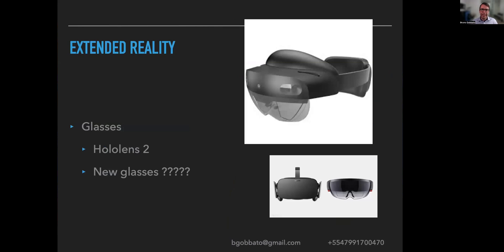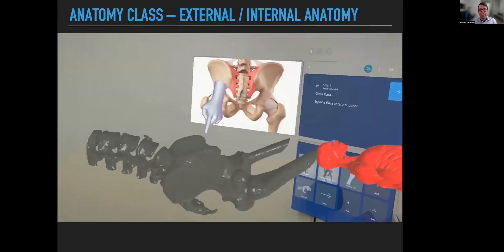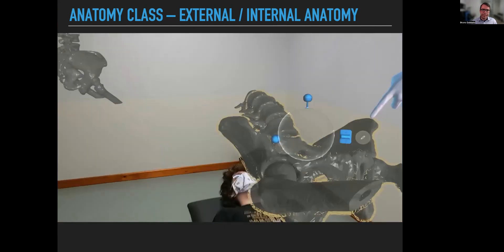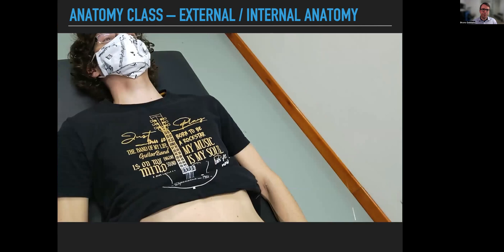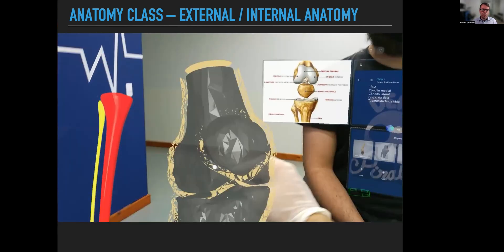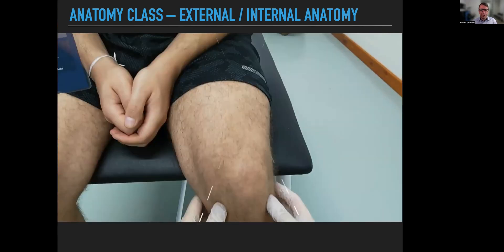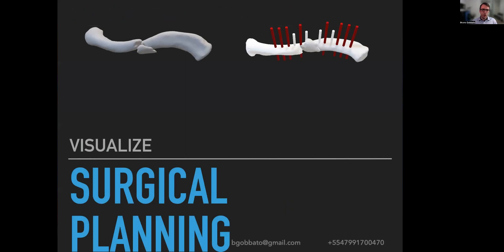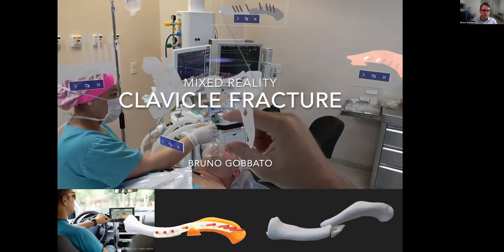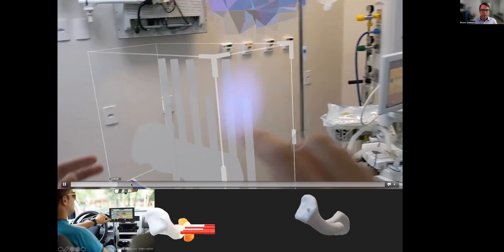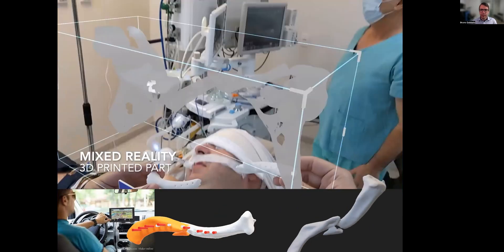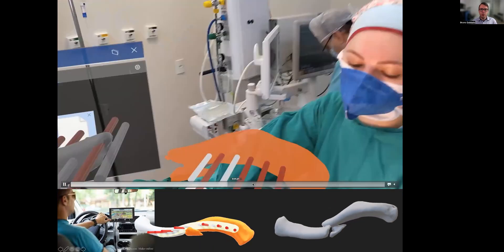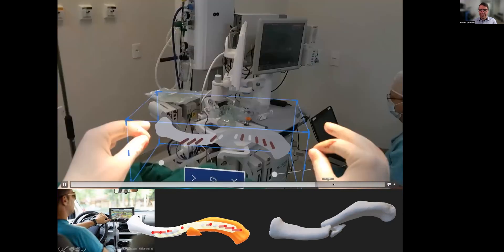For that, we need some devices — we call them glasses. I'm using the HoloLens, but there are other glasses and new glasses coming all the time. This is an example of teaching anatomy: I'm teaching students the external anatomy, how to do physical exam — in this case, teaching how to palpate the iliac crest and the knee. I'm showing the digital models where I'm palpating, and then I show where the students need to palpate. This is also how we show and visualize surgical planning — in this case, a very simple clavicle fracture surgery made with the guidance of augmented reality. We have the digital models, the lateral and medial fragment, and where each screw should be, and then we replicate our surgery.